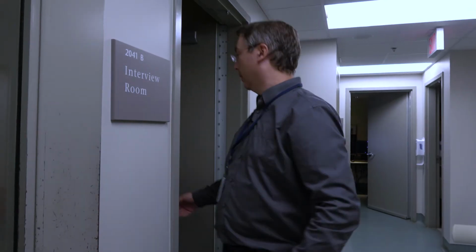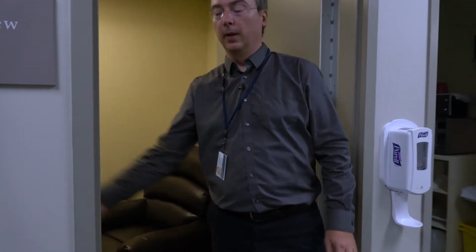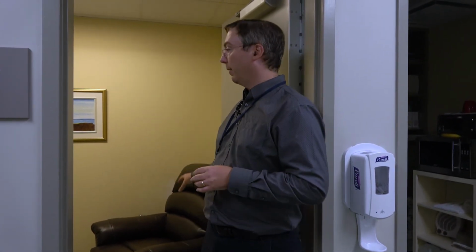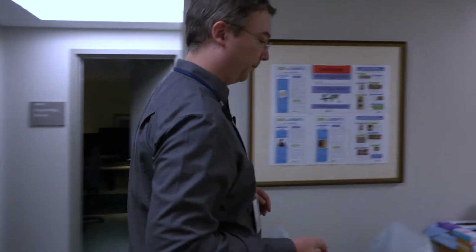So the first place that they're going to go is we're going to talk to them. So we're going to figure out a little bit about them, figure out why they're here, make sure that we're doing the right thing for the right person, talk to them about what they've eaten. Because a lot of the PET scans use sugar, we need to know what their blood glucose level is. If they've got really high blood glucose, it can actually make it harder to see some things. So we have a little chat with them, make sure everything's okay, and then we would move them on into one of the uptake rooms so that they can actually get the radioactive sugar.